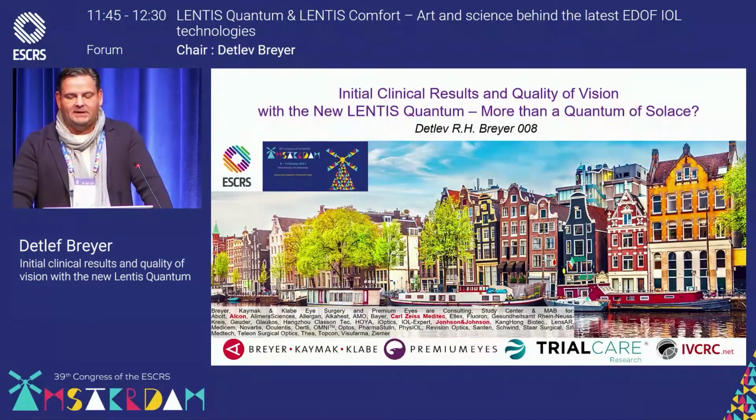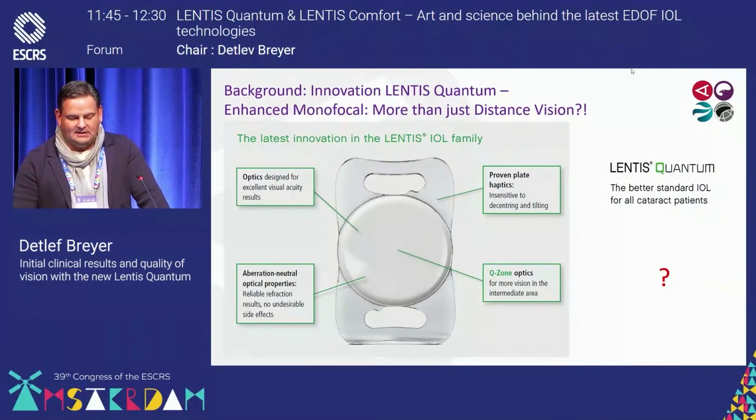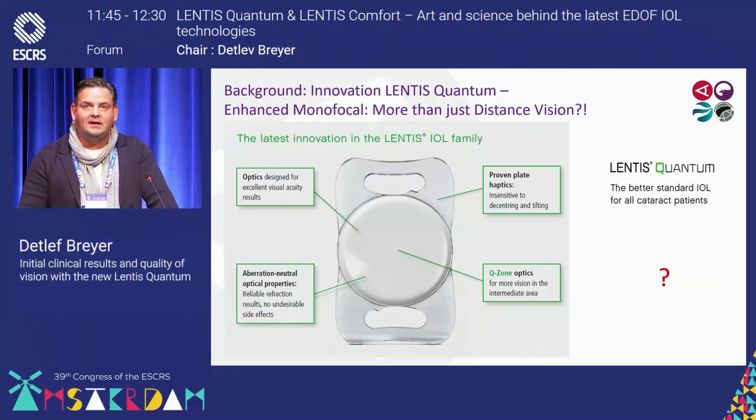So I was invited to talk about the quantum of solace, if it's worth having another lens like this. And this is the IOL I want to talk about today. And the question is, is it really a better standard IOL for all cataract patients?